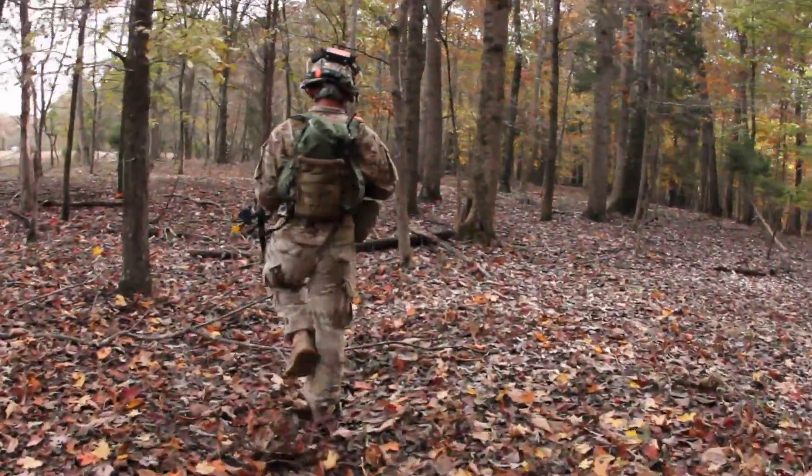We're working on a research protocol that's looking at the effect of hearing loss on soldiers' performance on a battlefield scenario. What we're doing is my partners in the research have developed a hearing loss simulator, so the soldiers mount that on the top of their helmet and it superimposes hearing loss through earphones inserted into the ear. With that we can look at how well they're performing out on a scenario battlefield.